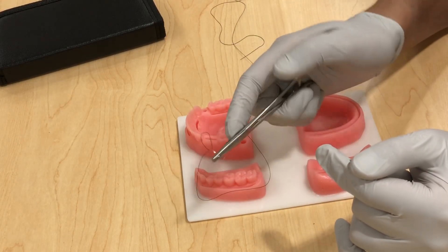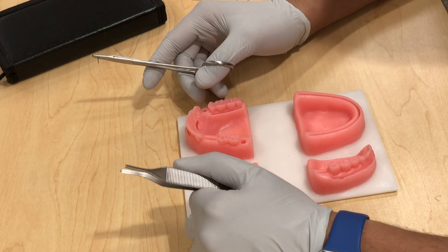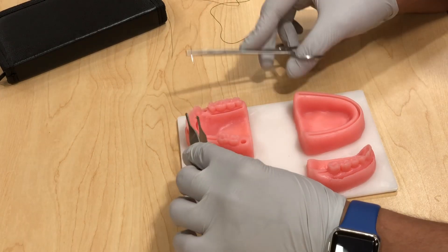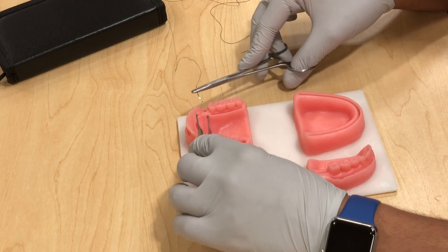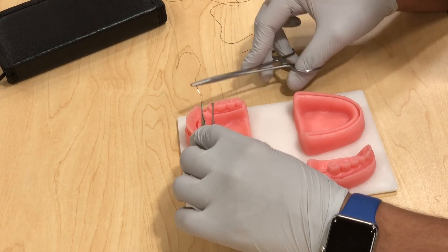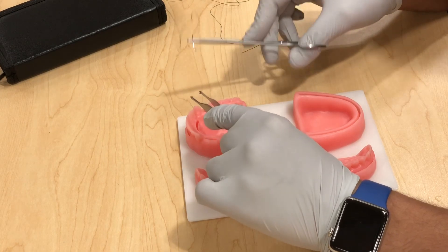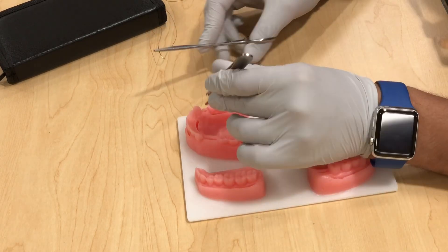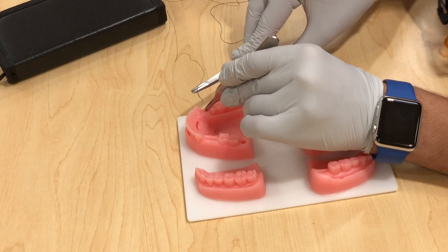Today we're going to start with the most basic suturing technique: the routine simple interrupted suture. You usually want to start from the buccal and go towards the palatal or lingual, so the knot ends up on the buccal side. This is very useful to avoid displacement of the knot by the tongue.